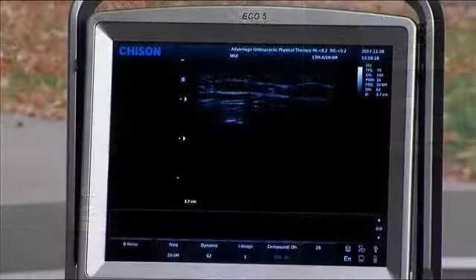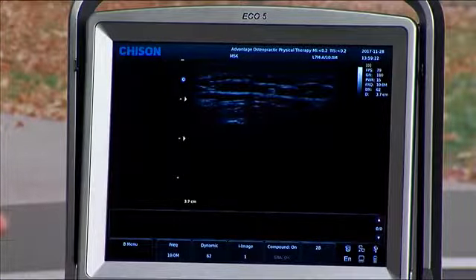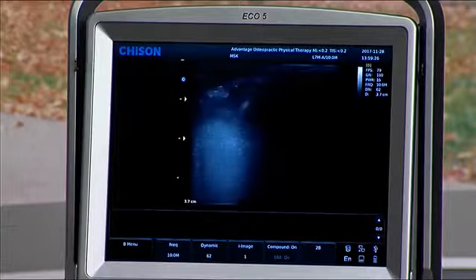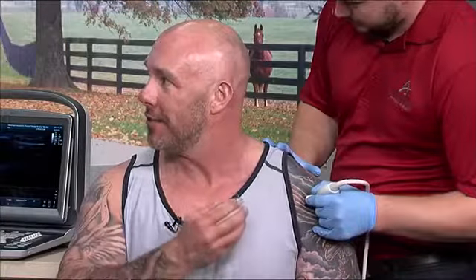Yes, sir. It's truly an ultrasound, a bit like an MRI, something that someone would have if you were pregnant. Is that correct? It's pretty much the same machine, and typically in physical therapy we think of ultrasound as a heat therapeutic modality, and this is different because this is a diagnostic imaging modality, which allows us to see the problems that we're trying to diagnose versus just testing them with our hands.